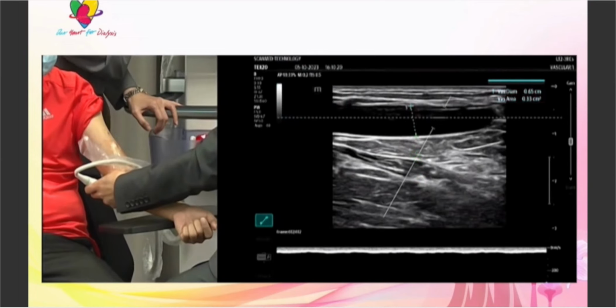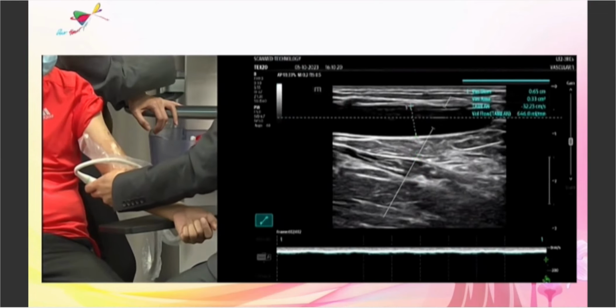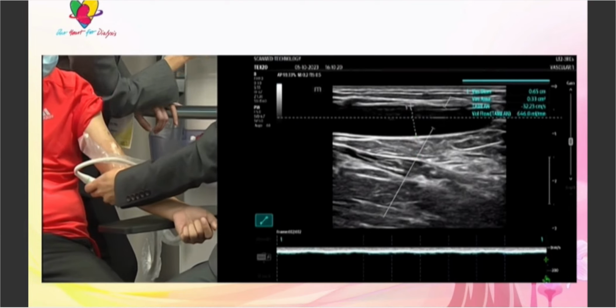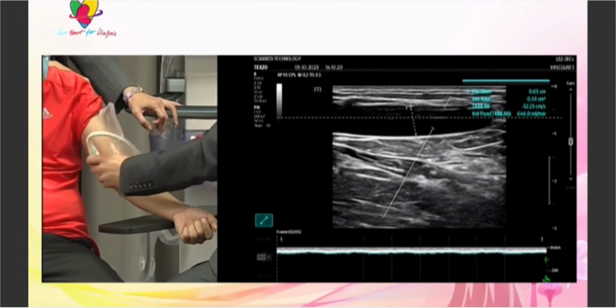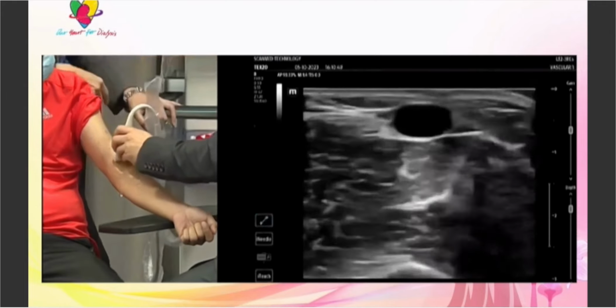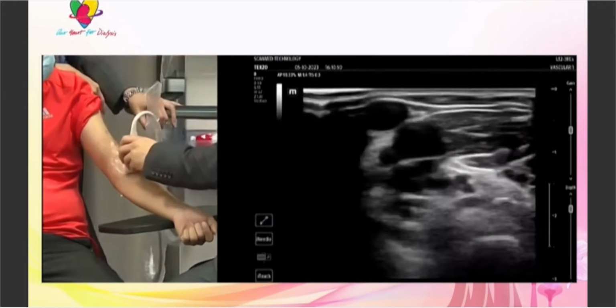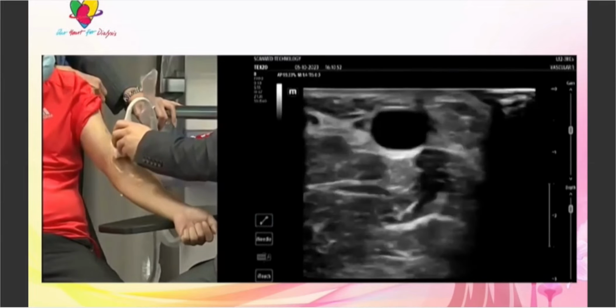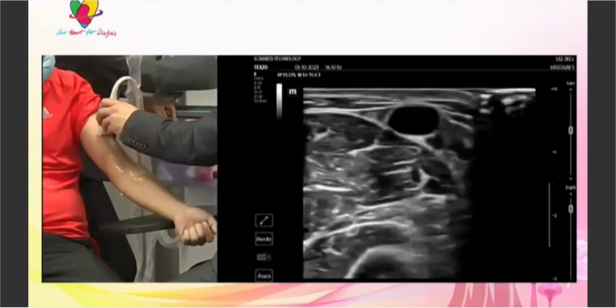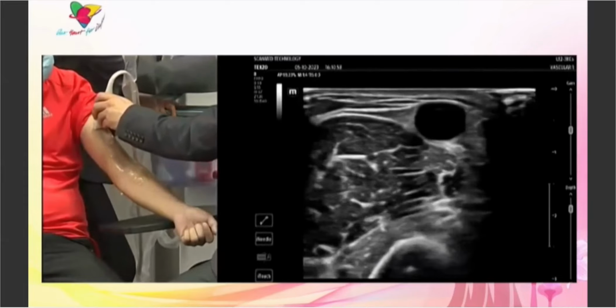So this would be, what, 640. The machine says 640, and it's in the vein. It's approximate. So one third is in the basilic, and then we go back towards the cephalic. This is the cephalic. So we see decent caliber. We see it's really superficial up until the proximal upper arm.